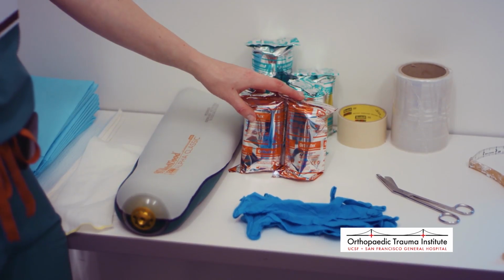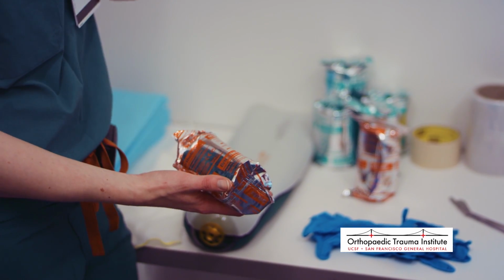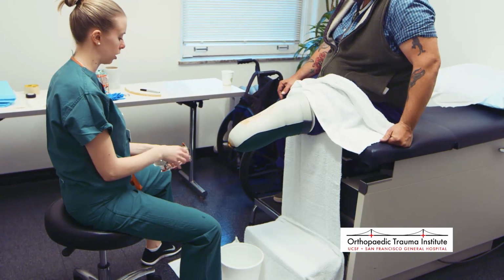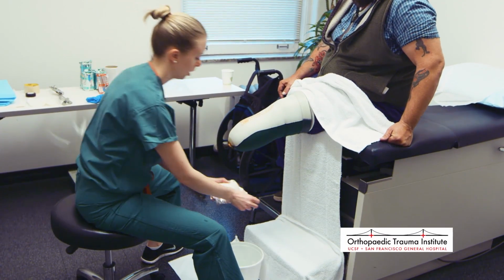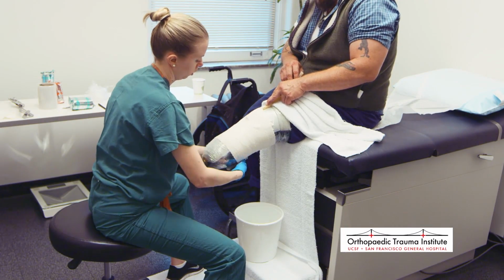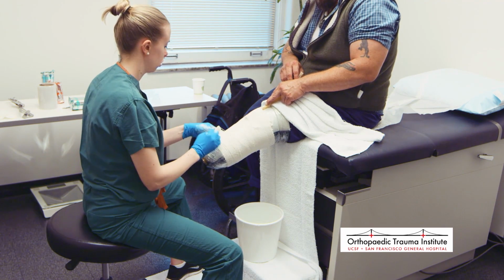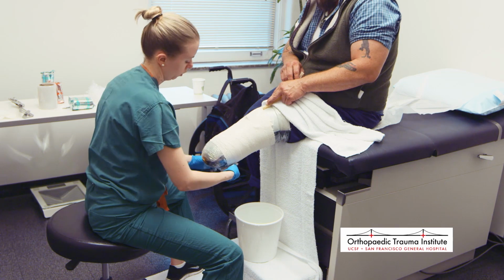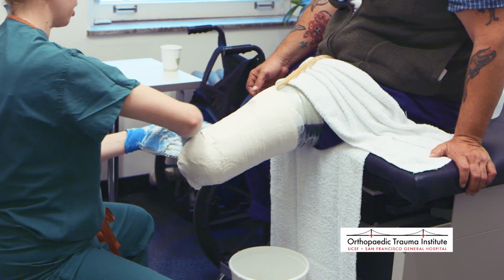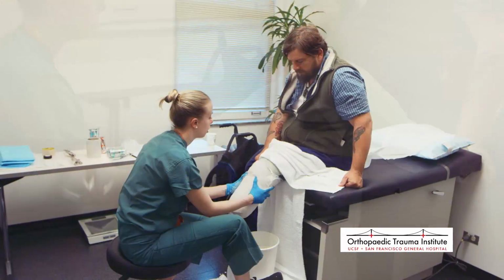Then we have our plaster. We use plaster for casting instead of fiberglass most of the time. We think that plaster gets a really nice intimate mold. So I'll use a variety of different plaster wraps and water to capture the shape. We make it really thick, and sometimes it can get a little warm during the casting, but with the gel liner, it acts as a barrier, so it should never be uncomfortable.